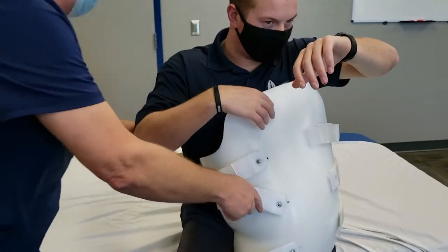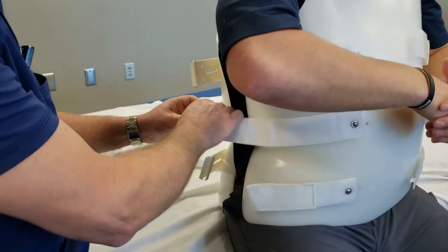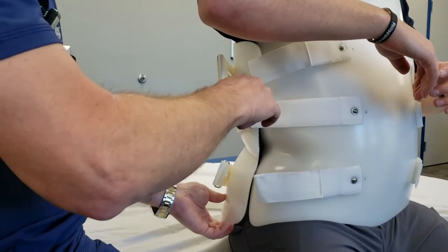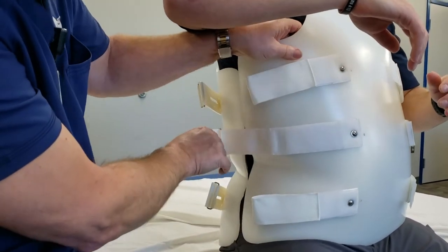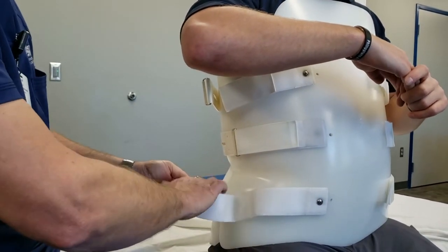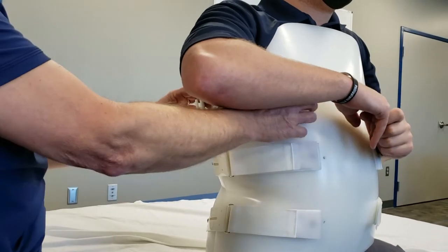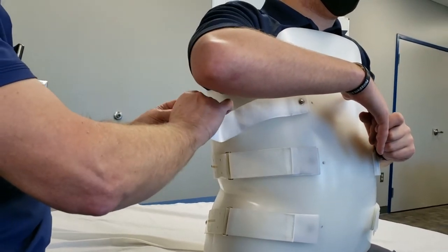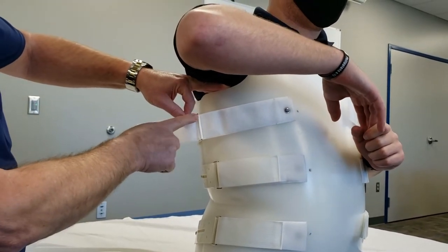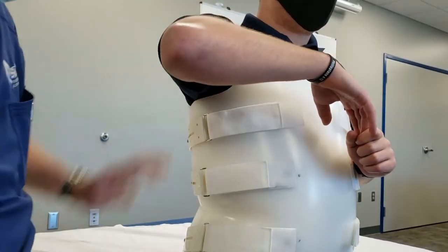The front should go over the back, and then we're going to bring the other side together. Start with the middle strap. You might have to get a gown or t-shirt out of the way. This is in some ways a little more difficult than fitting lying down, but it is sometimes less troublesome for the patient. One thing I would recommend: under the arms, be really careful with these little rollers — they can pinch skin if you aren't careful.